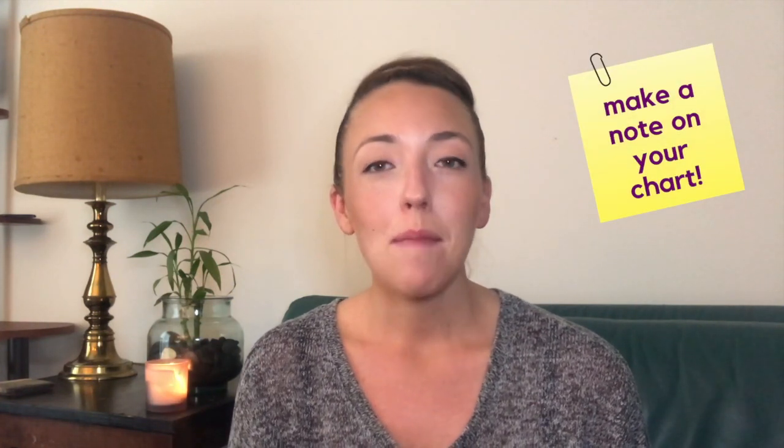If it is a little bit off from your normal time, you just want to go ahead and make a note about that on your chart so you know. But typically, if you've slept the same amount of time that you usually do and you're within about an hour in either direction, you're fine, no big deal. It's more important that you think about taking your temperature every day no matter what, and just making those notations if the time is a little bit different.